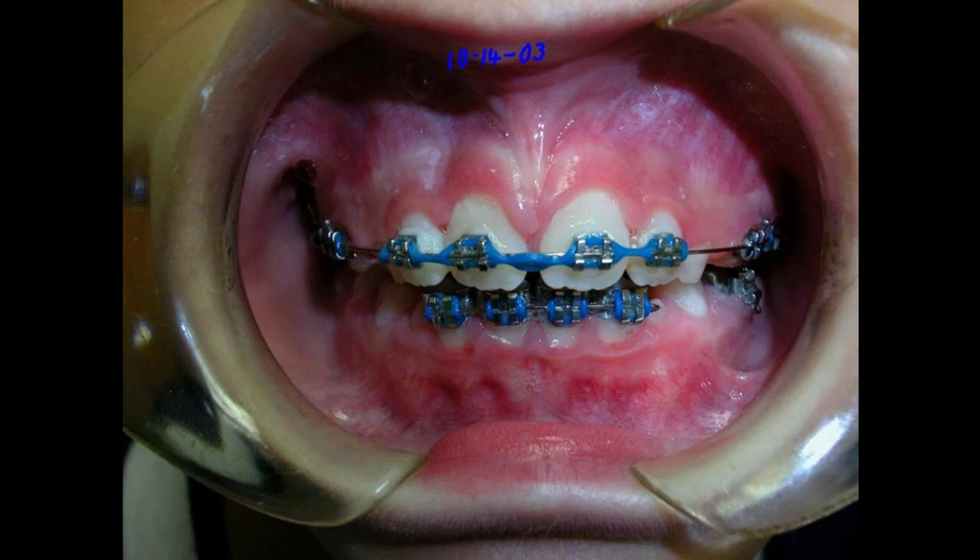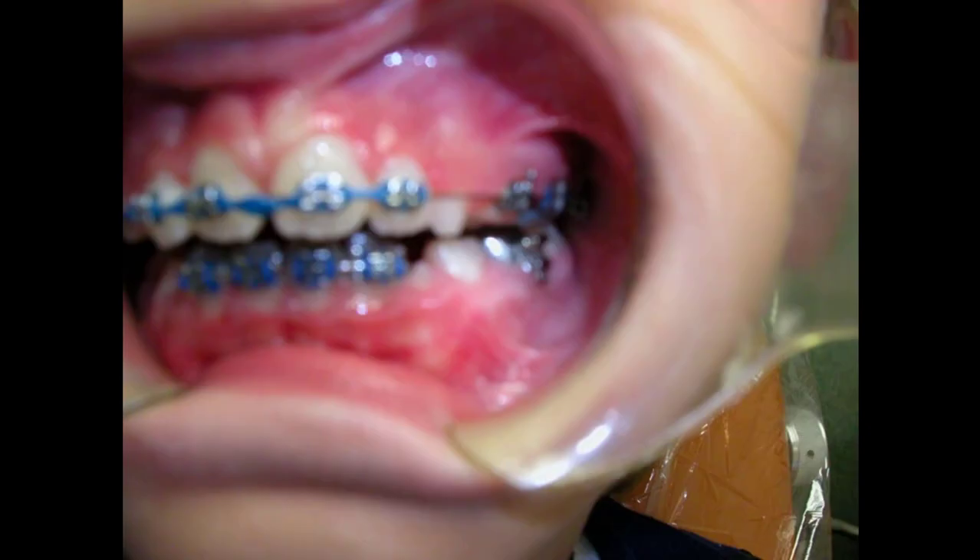Things are going our way and looking pretty good. We've separated the palate — we took this off, put on the elastic chain, and we'll close these teeth together. The palate is going further out. When we first started, the lower arch was much wider than the upper arch, which causes the patient to shift their jaw to one side. She was shifting a little bit — putting the thumb in and using her left thumb, which curved this around — but it's lining up pretty well at this point.